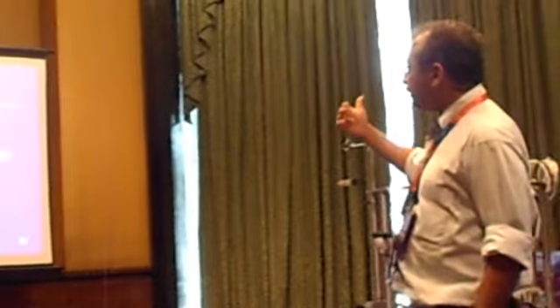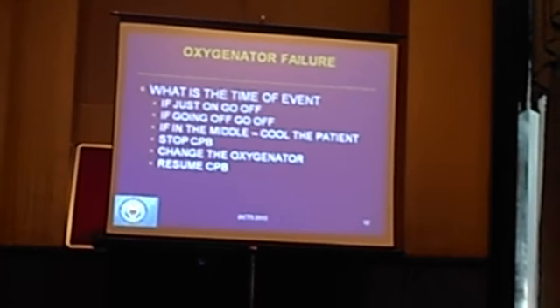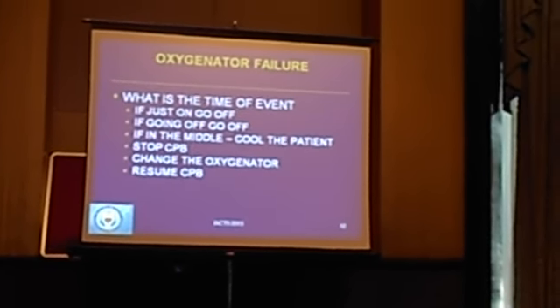People have made this mistake: come off bypass without oxygen on. If that happens in the middle, then you are in trouble. Then you must rapidly cool, what is called crash cooling, because you are going to have to change the oxygenator.